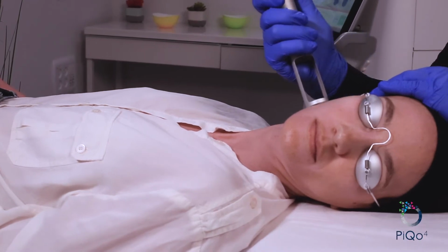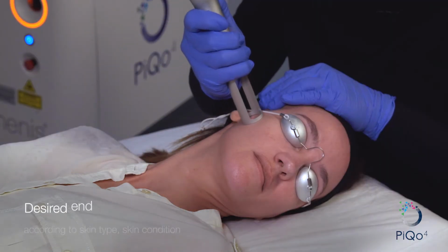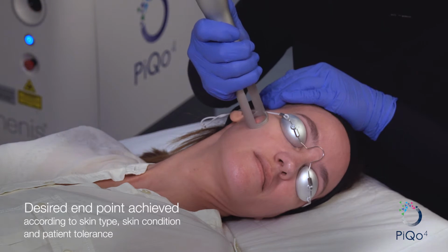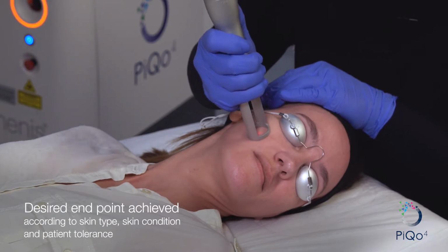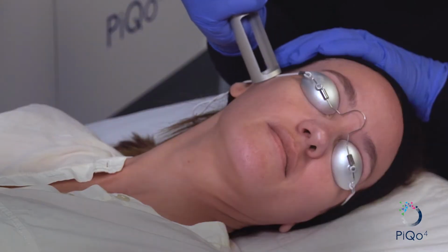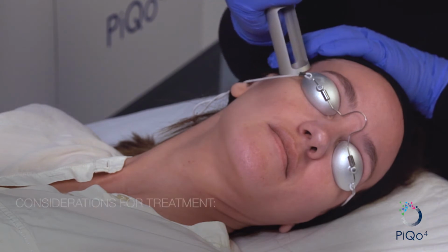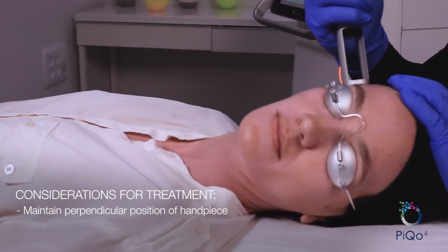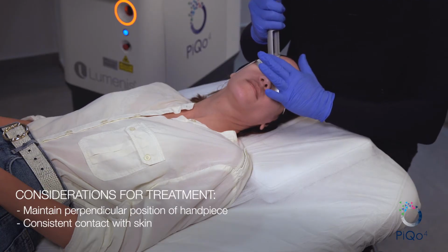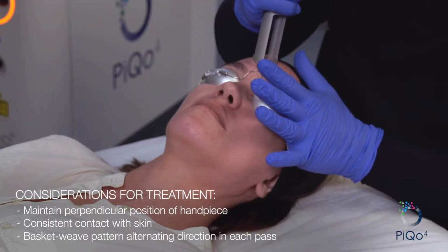When performing the PicoFractional treatment, there are several things that need to be considered. First and foremost is to obtain your desired endpoint. This will be determined on an individual basis by skin type, skin condition, and patient tolerance. Parameters for the treatment will be 1064 nanometer wavelength and 800 picoseconds. Considerations for treatment should be to maintain a perpendicular position of the handpiece with consistent slight contact with the skin. Treatment should be done using a basket weave pattern, alternating direction after each pass.